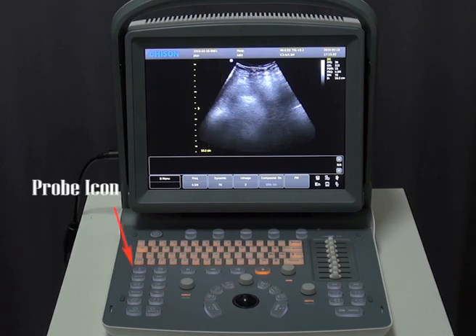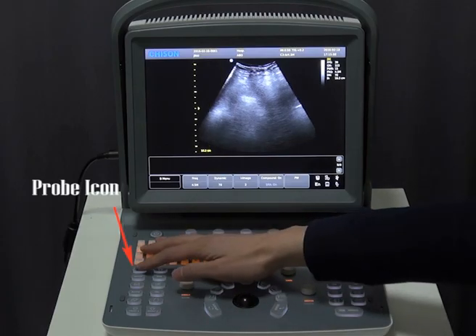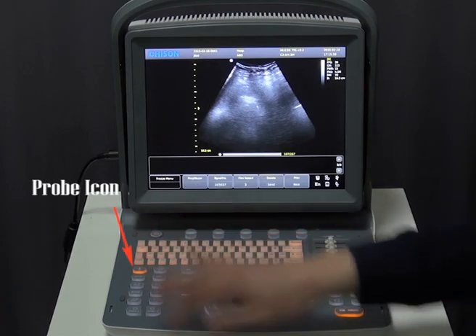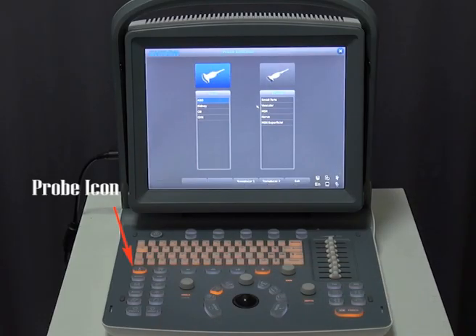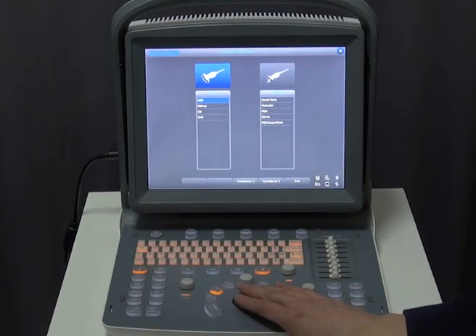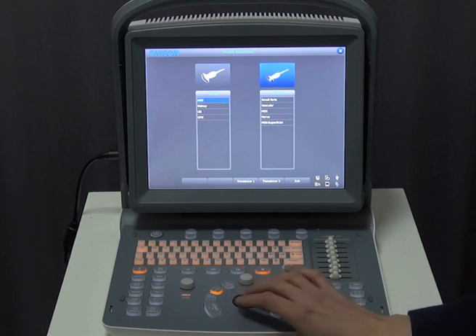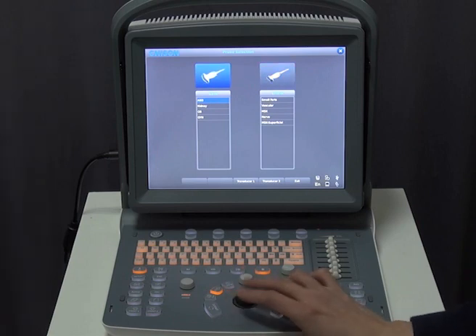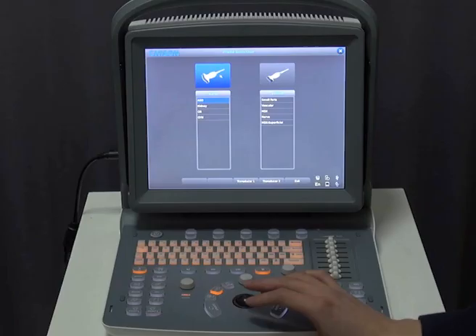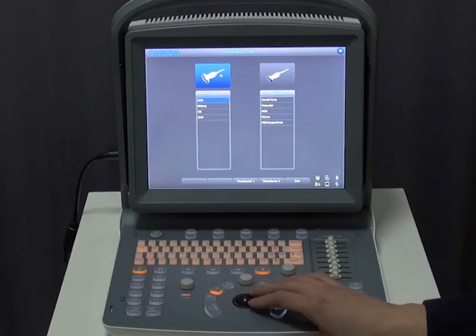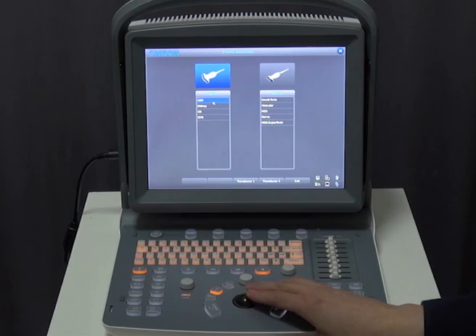Now to start the exam, we are going to select the probe icon. This is the main exam menu. Two probes are available, and each probe has several presets. We are going to choose the abdomen preset — click on abdomen.